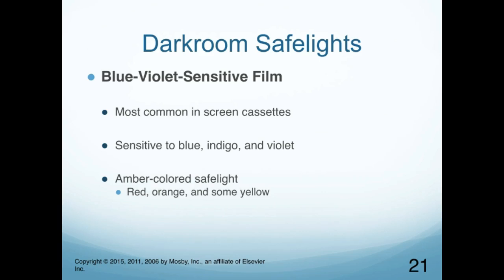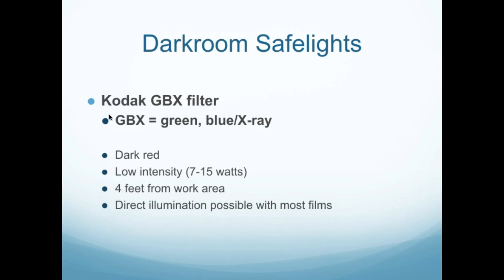Typically red. So speaking of red, good old Kodak's GBX filter. GBX stands for green, blue, X-ray, and essentially X-ray film is what it's sensitive to. So it is dark red. It's low intensity. Usually it would max out around 15 watts.